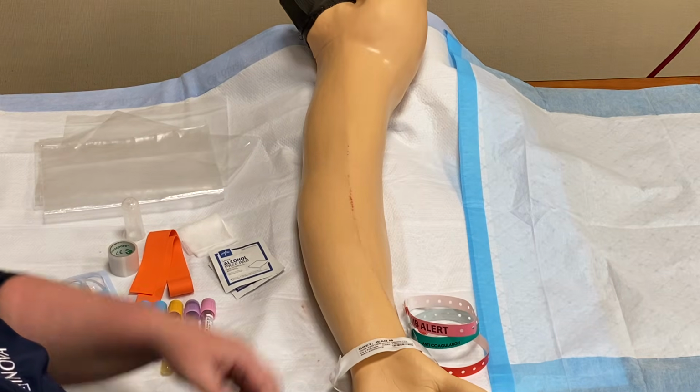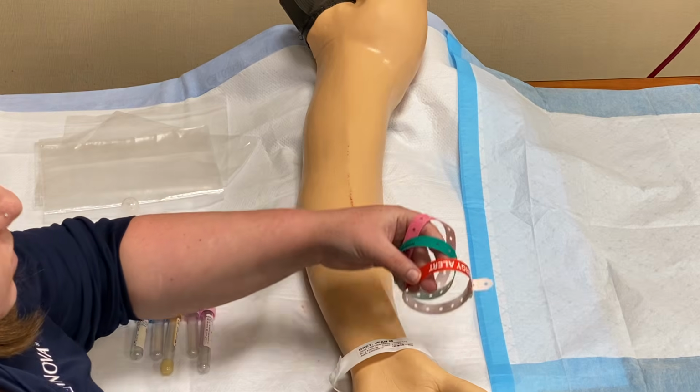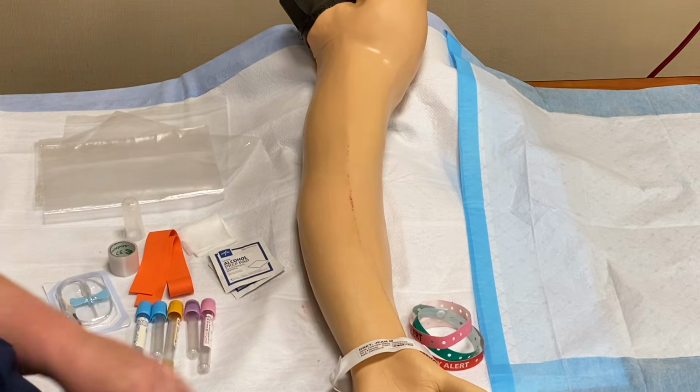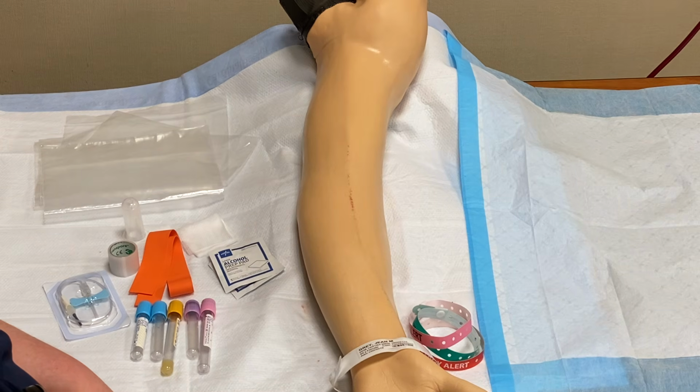I also want to cover allergies, and I do see that there's an allergy bracelet on her arm. So I want to make sure that she's not allergic to anything we're going to be using for this. So, Miss Gray, are you allergic to rubbing alcohol? No. Or adhesive tape? No, she's not allergic, so we're in the clear.